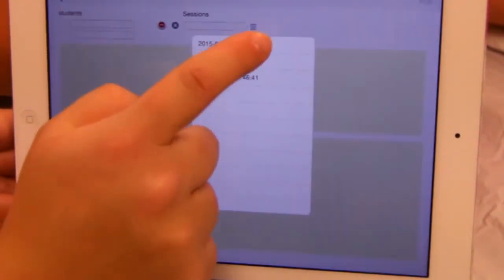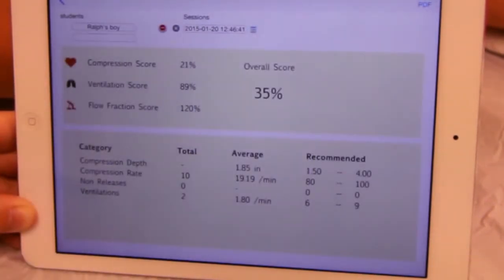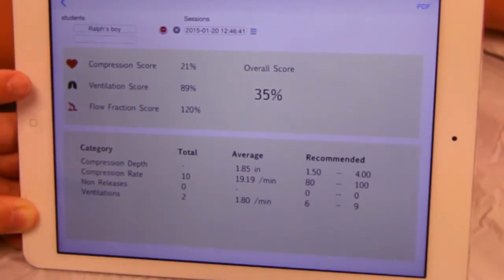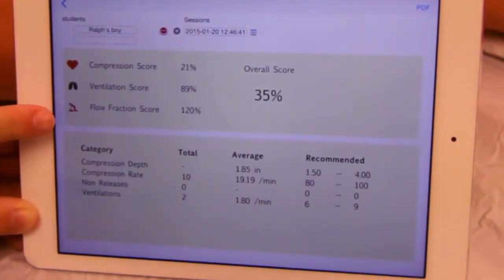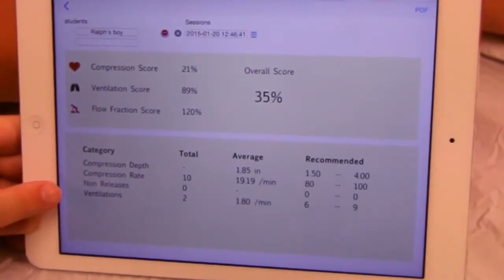When you go to the results, you can pull down the list of training sessions — the bottom will be the most current. This session was incomplete, so there is a low score, but it reflects the quality as well as the quantity of what was completed.